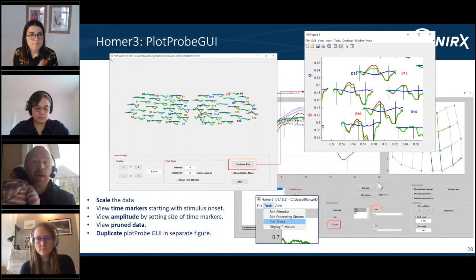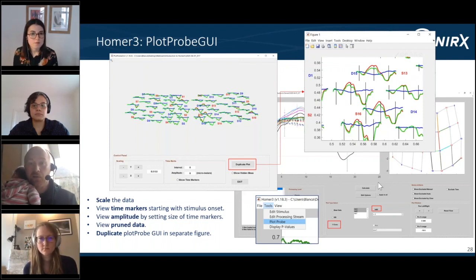It's a lot lighter in the pre-processing, the principal component analysis and a lot of the filtering that is the basis for Homer2 and Homer3. Over the years, we've put in a lot more of that pre-processing, so now my toolbox has many of the options that Homer has.